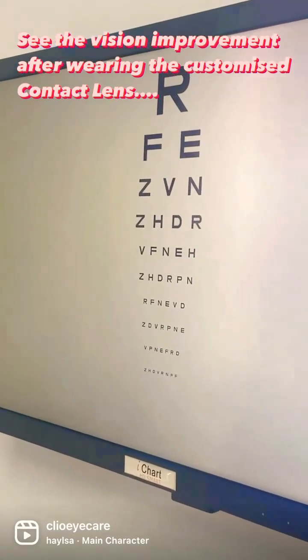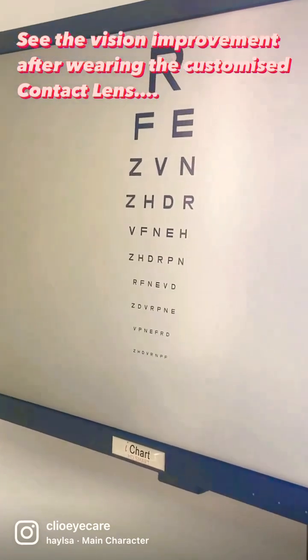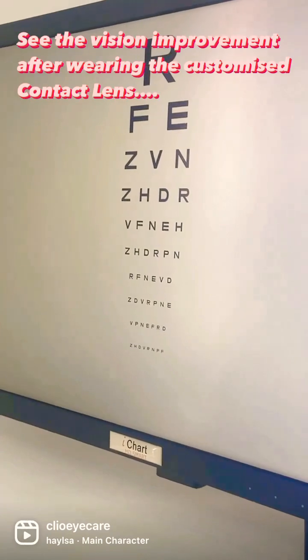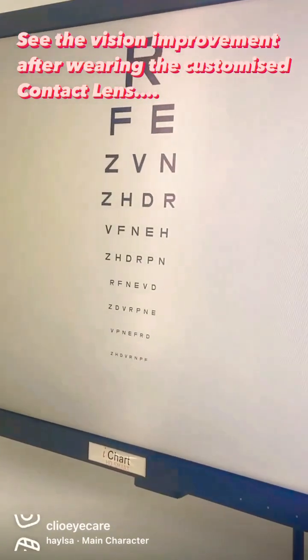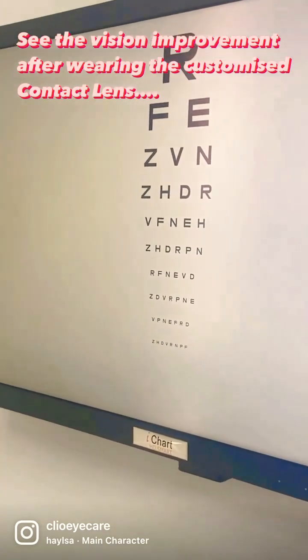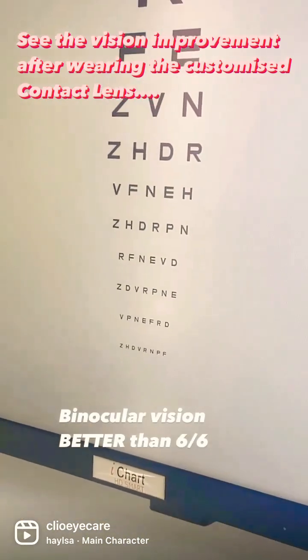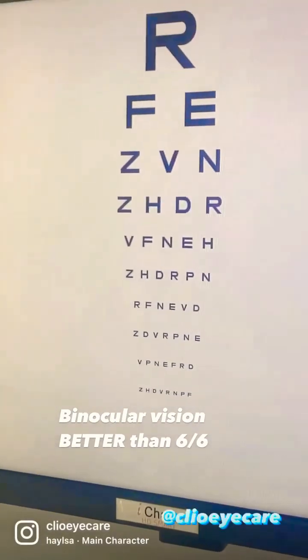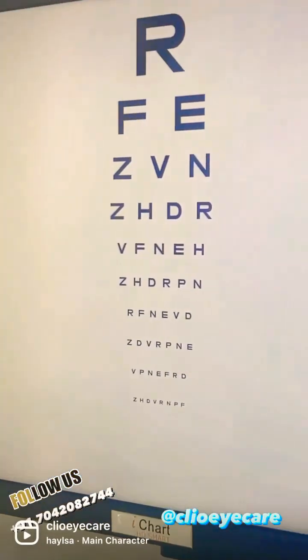R, FE, ZVN, ZHDR, VFNEH, ZHDRPN, RFNEVD, ZDVRPNE, VPNEFRD, ZHOVRN. That's really good! So even with keratoconus, see — visual rehabilitation is possible, and to nearly 6/6. So it's never the end of the road.